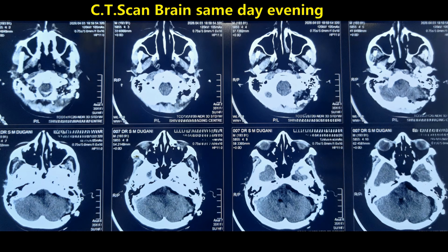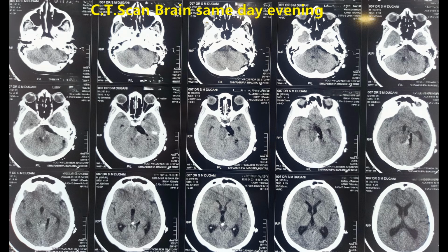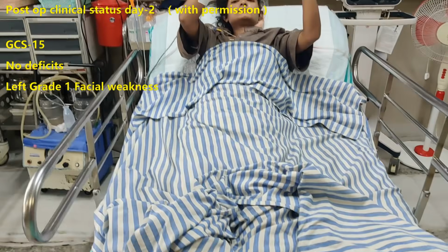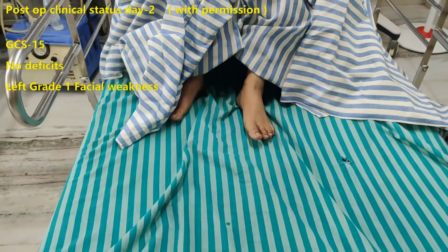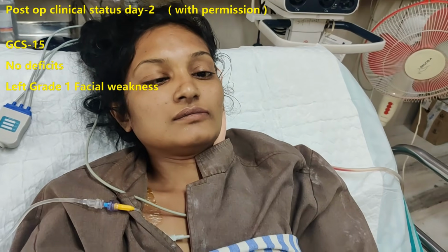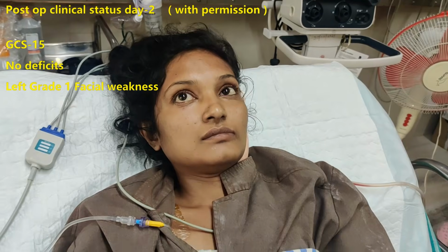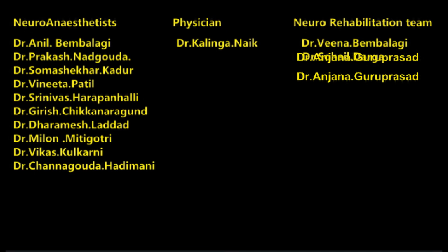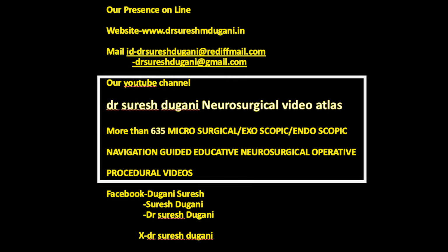Same day evening CT scan shows complete excision, no hemorrhage, edema, swelling, or infarction. Ventricles are normal. This is her post-op clinical status on day 2. Glasgow score 15, no deficits. Lower left side, grade 1 to grade 2 facial paresis, and no other deficits. She's taking orally. This is our neuroanesthesia team, treating physician and neuro rehab team.